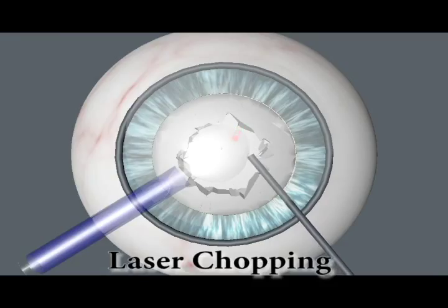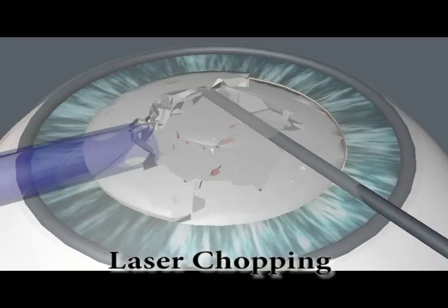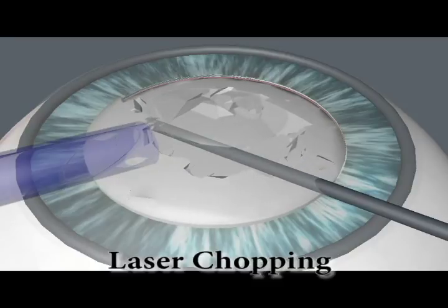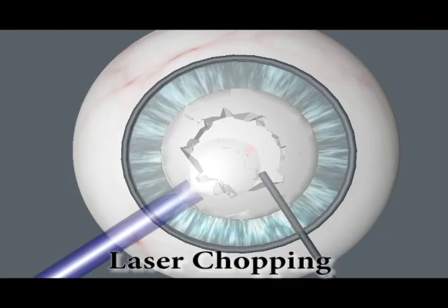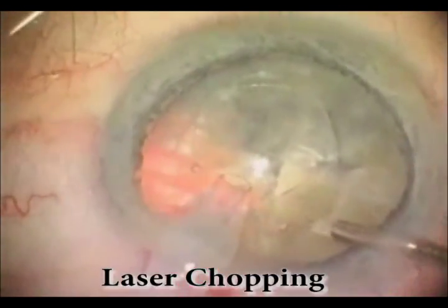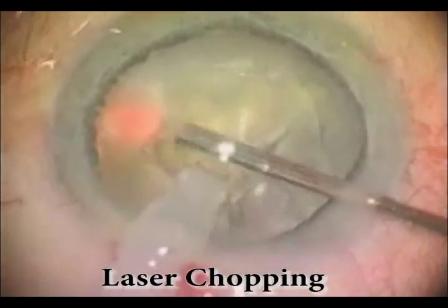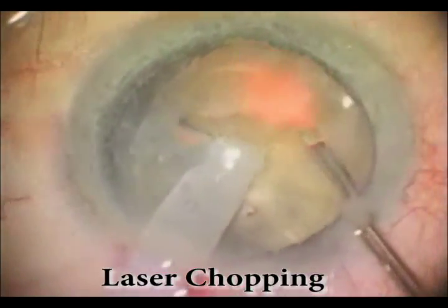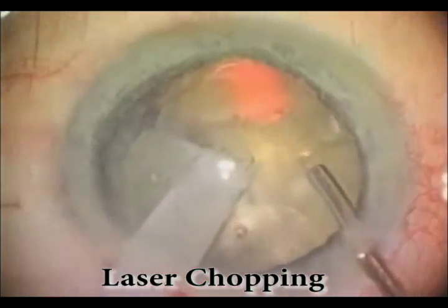Second stage, laser chop technique. Using the energy of the acoustic wave of laser impulses, the chopping lines are made without any mechanical pressure, dividing the lens nucleus into four fragments. For 5 to 15 seconds, the laser tip is fixed over a conjectural chopping point, and the surgeon observes the appearance of the chopping line. Generation of radiation is stopped only at the moment of forming of the chopping line, going from the periphery towards the center or after connection to already formed chopping lines.